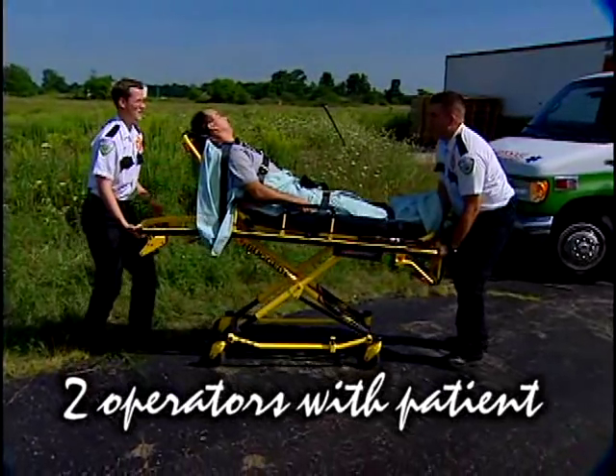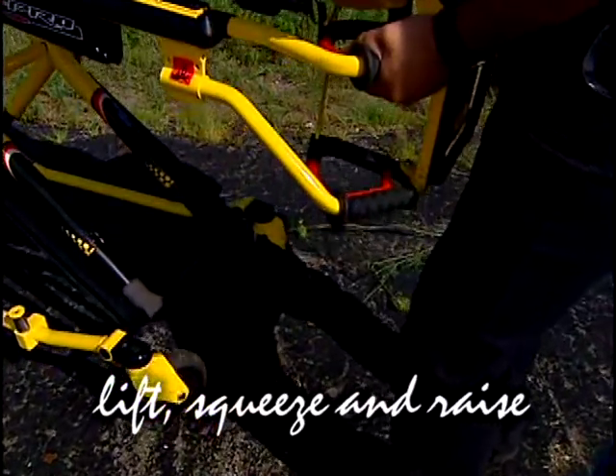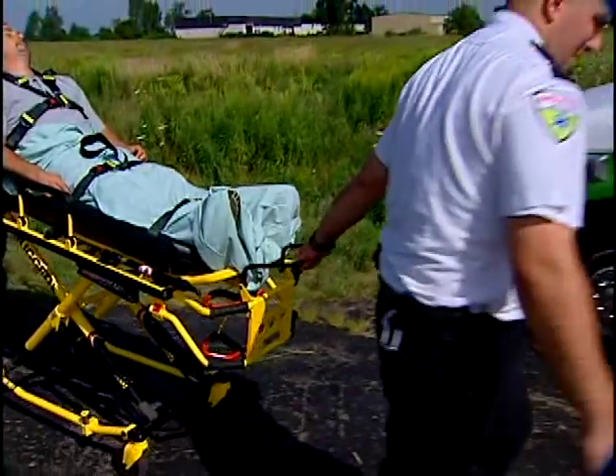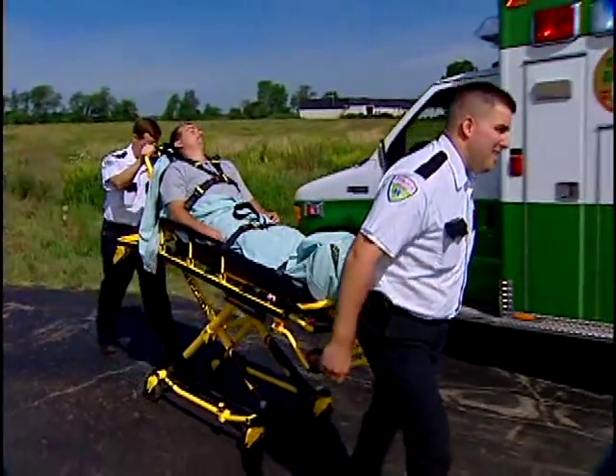To raise or lower an occupied cot, lift the litter frame just enough to take pressure off the height adjustment mechanism. Squeeze the release handle and raise or lower the cot to the desired height. Keep in mind, good safety practices require that you use two operators to load the cot with a patient.